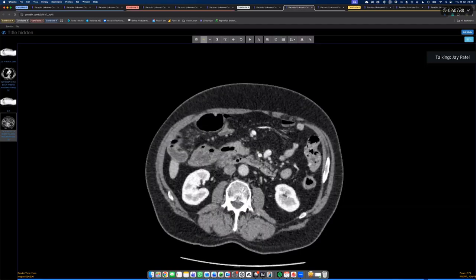Clearly, in this case, there's widespread disseminated metastatic disease at this point, right? You've described that. Now, that doesn't mean that it's not resectable. Colorectal cancer is treated in very different ways, particularly in the UK. We treat it more like an oligometastatic disease. So we'll happily chop out the primary and carry on chopping out the metastases as they form, unlike some cancers where as soon as it's metastatic, your only hope is chemotherapy.